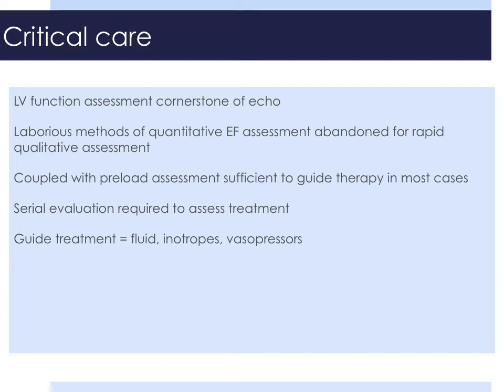The LV function assessment is probably a cornerstone of echocardiography and is one of the first assessments we learn once we learn echocardiography. There are several quantitative and laborious methods which are generally part of level 2 accreditation. The aim of level 1 of a focused heart scan is actually to assess, together with the preload assessment, a qualitative assessment of LV function to guide our therapy.